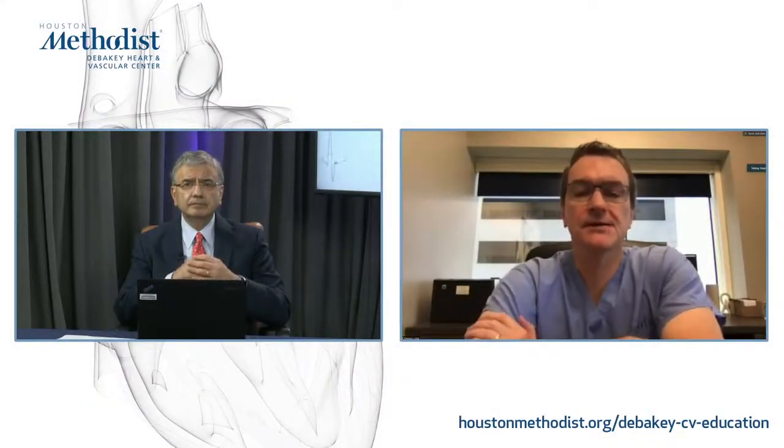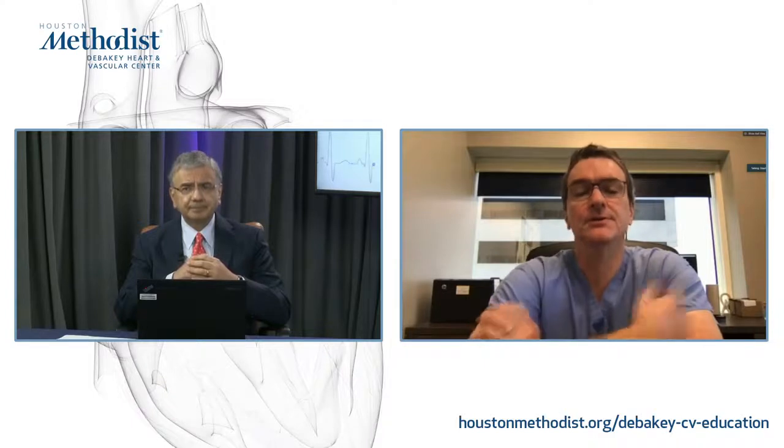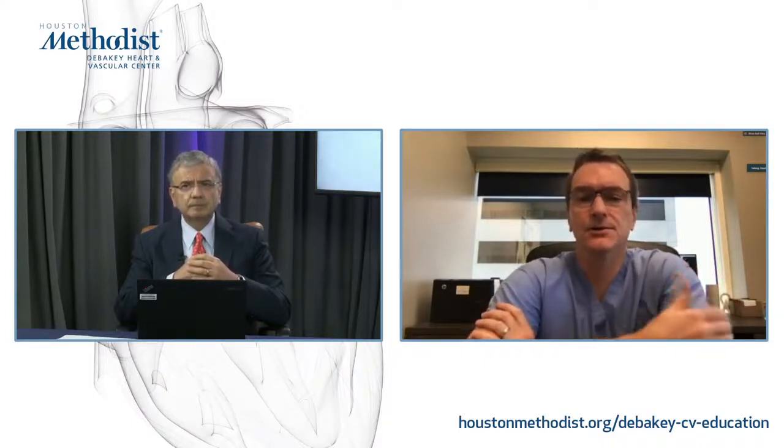I would completely agree. I think the application that seems best suited is still TR, where you have incomplete jets. If you're going to see an incomplete jet, that's where it is. You rarely see an incomplete aortic stenosis jet.